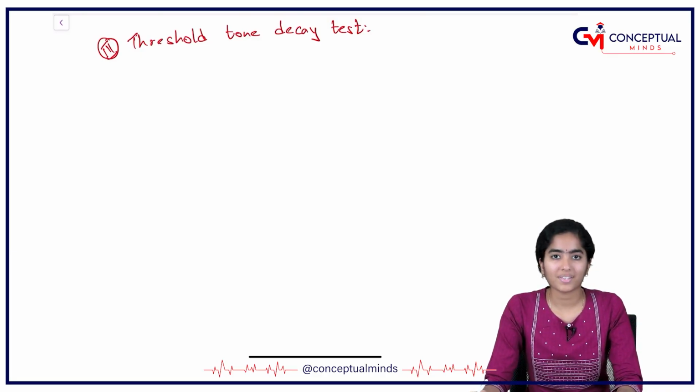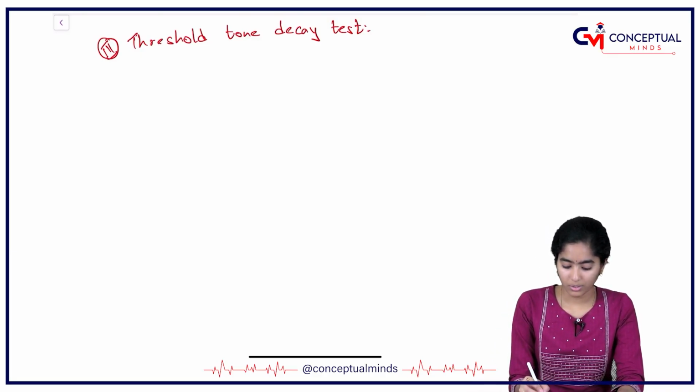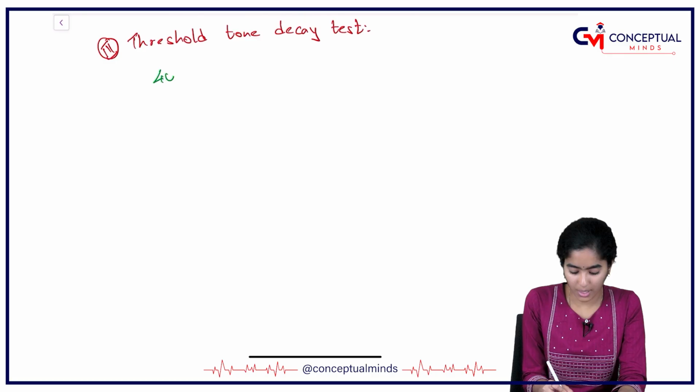So how do we perform this test? We take a pure tone of say 4000 Hertz.